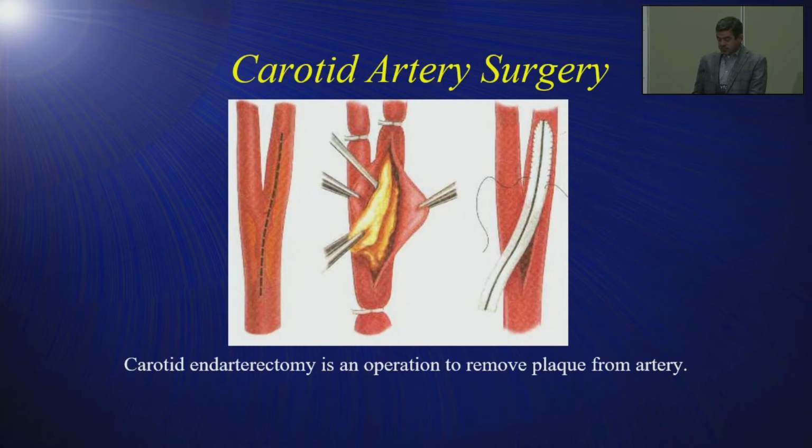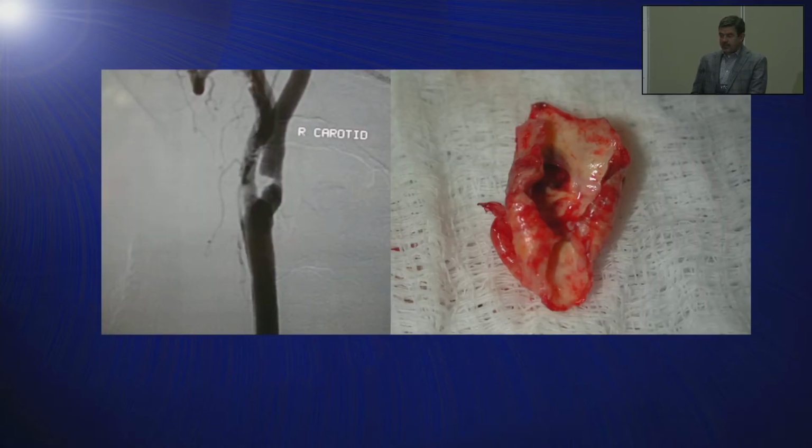And a lot of times we would put a patch on. This is a patient that had a TIA, monocular blindness of one eye, and then we did an ultrasound and found she had a stenosis. If you see this little area right here, this is where the plaque ruptured, and the debris from the inside of that plaque fell out to the circulation and then up to the brain, and that's what caused the TIA.